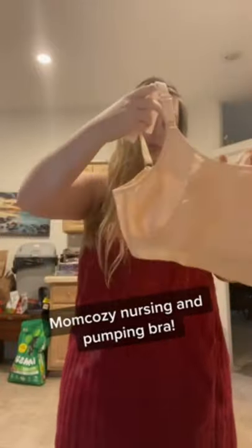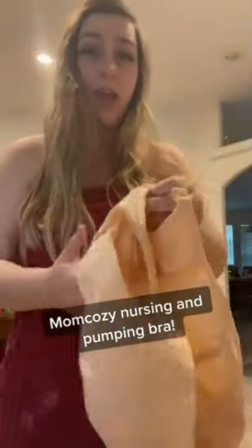Hi guys, I'm here and I've got my brand new Mom Cozy nursing bra. I'm going to go ahead and put this on and give it a shot. It's a nursing bra and a pumping bra. It's got these little openings here and I'm going to hook it up and see how it goes.